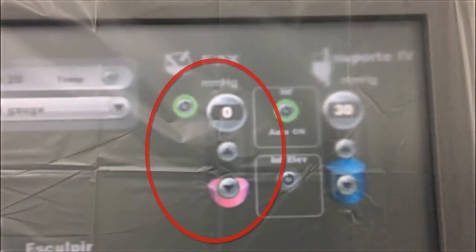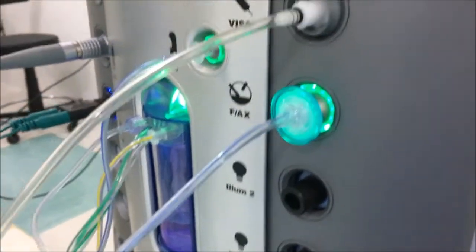You are just about to finish your vitrectomy. The periphery is shaved and laser has been done. So let's perform the fluid air exchange and go home.